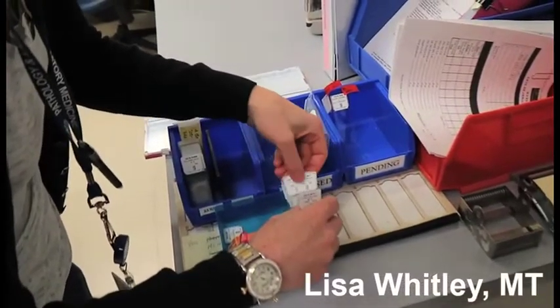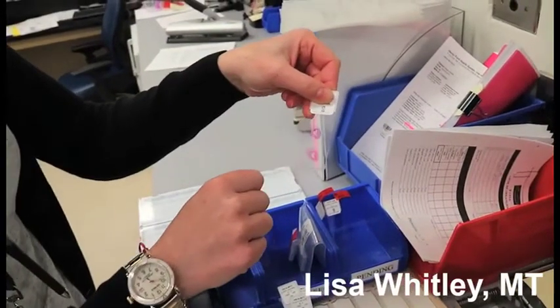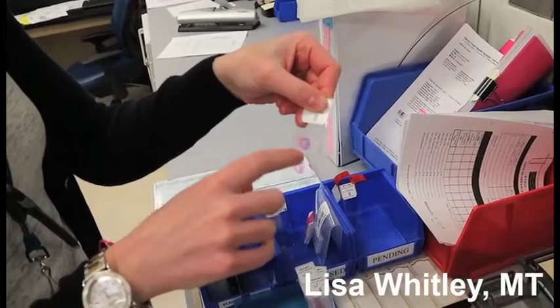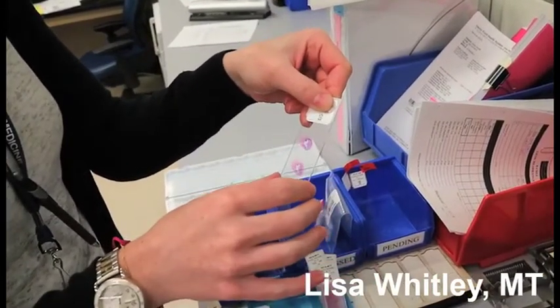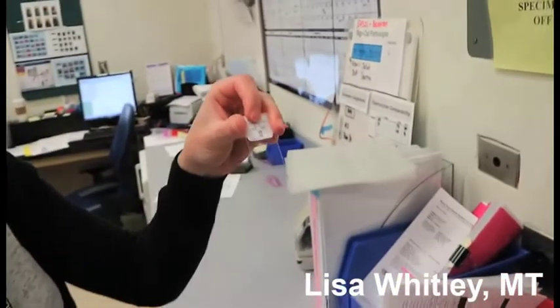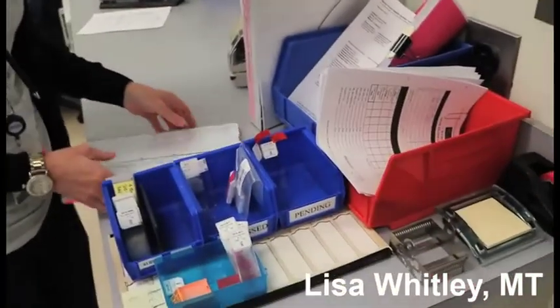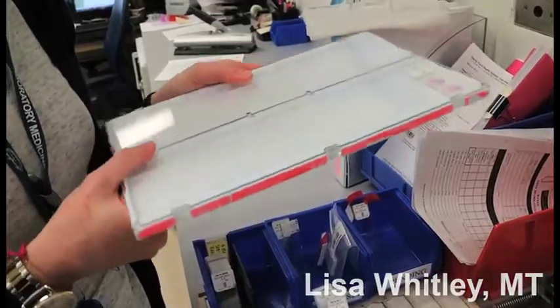Let's have an example. They have to let us know which portions are tumor and which portions aren't, because we're not trained pathologists. And we just want to isolate DNA from the tumor region, because we'll give the patient a false negative if we isolate normal. So this takes you, what, Dr. Sharma? Like a minute to do? Yeah. So we color-coded our slide trays so they know that this is just a quick review.